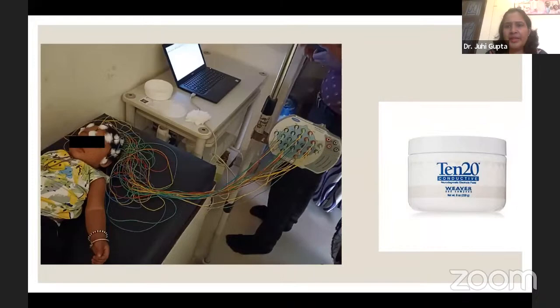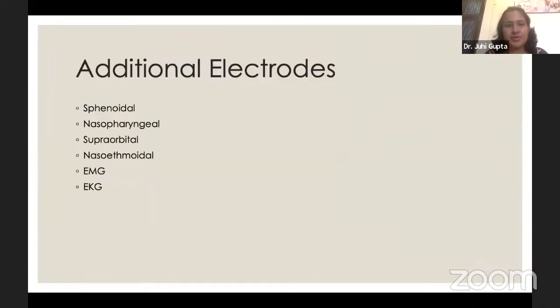So this is how typically a digital EEG machine recording looks like. The setup looks like that the child lies on a bed and you are applying the electrodes using a gel, and they go to a jack box, and you have the laptop with you wherein you can record the EEG. Thereafter you can report it and take a printout of the report. Usually a conductive gel is used to place these electrodes. A gel or a collodion can be used, but commonly the gel is used.